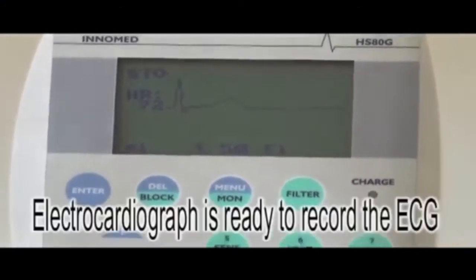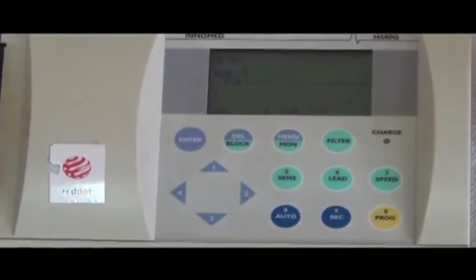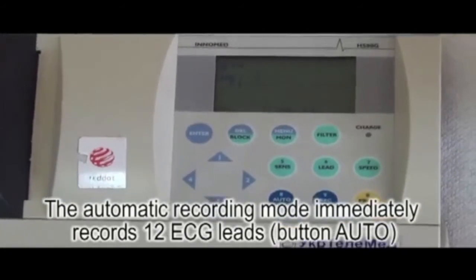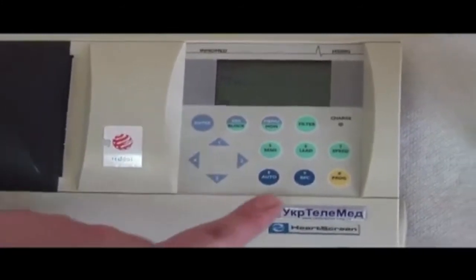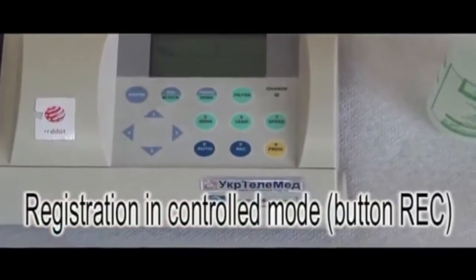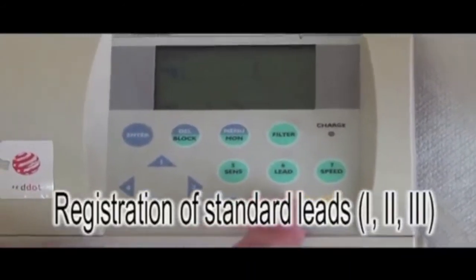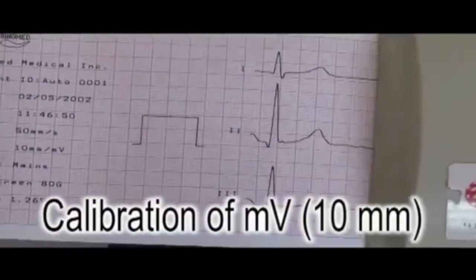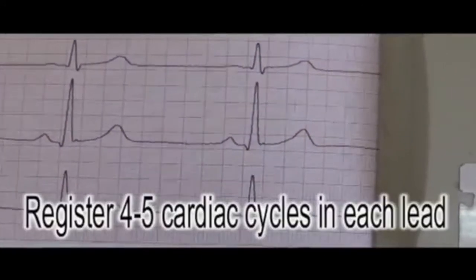The electrocardiogram is ready for recording. You can register ECG in automatic mode, which records all leads at once, or in manual controlled mode. For registration in controlled mode, press the REC button. We record the first, second, and third standard leads — as usual, four or five cardiac cycles in each lead.